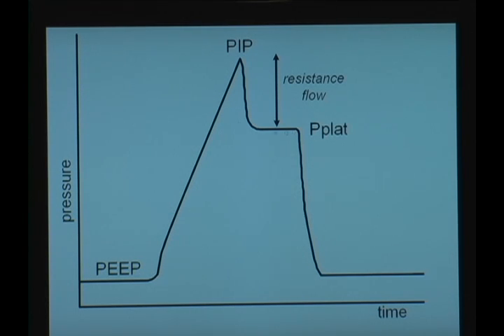So in that patient, is that high pressure injuring the patient's lungs? So we go to the bedside, severe acute asthma, the PIPs are running in the 60s, plateau pressure is 15. We are not injuring the lungs because the lung parenchyma, the alveoli, are only being distended with a pressure of 15 centimeters of water. And then we can follow the PIP to plateau difference to evaluate the response to bronchodilators, steroids, and so forth, because what we would expect to happen over time is that this gradient would decrease.